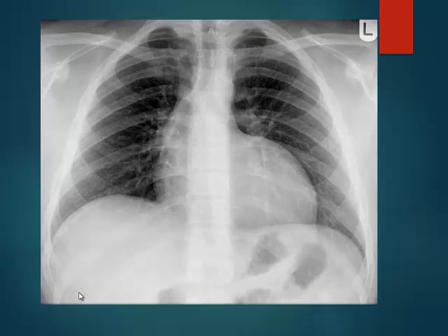cardiomegaly, boot-shaped heart. You are after boot-shaped heart and fellows, aren't you? Okay. Yeah, you could say it looks a bit like boot-shaped heart. And I can't explain why there's a bulge here of the right ventricle in this case. Anyone else? Anything else? Actually, it's subtle. I think I should tell you what it is.